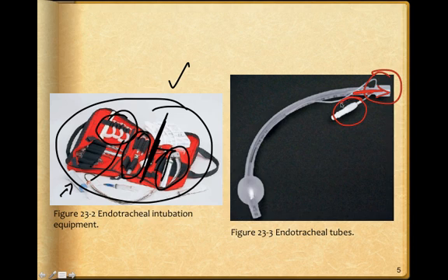This is a distal cuff, and the air pressure that you feel here when squeezing it is generally the air pressure that is in here. There's a Murphy's eye down here, and it's a good spot to be able to locate. The stylet that goes in here and makes this rigid should not go below the Murphy's eye.